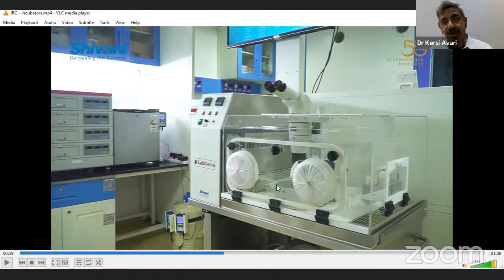You have got infusion of carbon dioxide, you have got temperature, you have got a humidity tray, and this is where the tubes in which your flushed aspirates of the oocytes will come in place. So you can scan, you can handle. These are the hand inserts. These are, of course, your toggle switches over here.